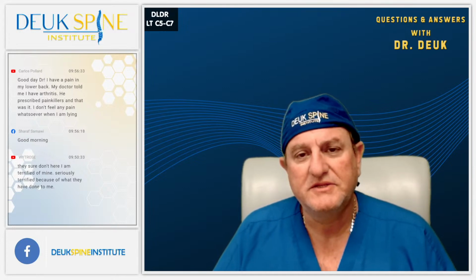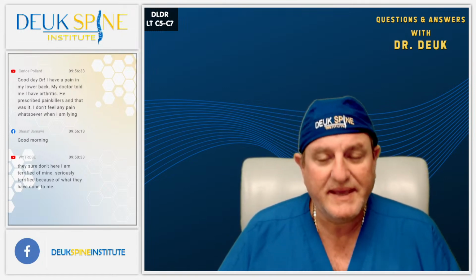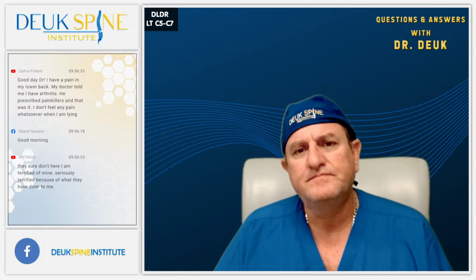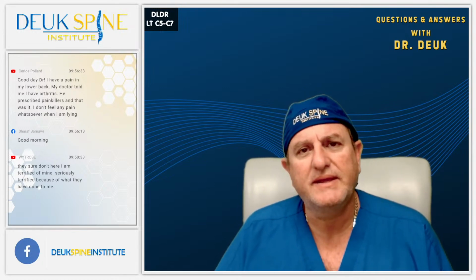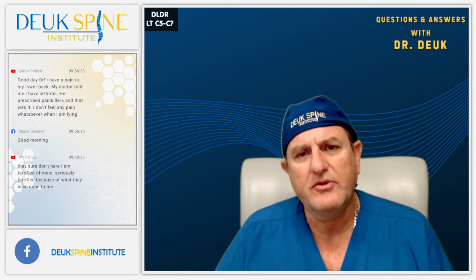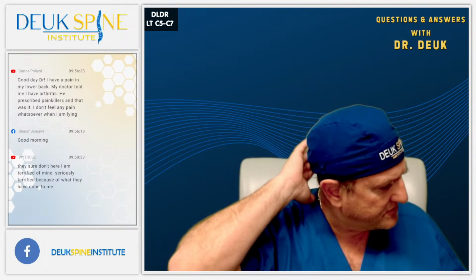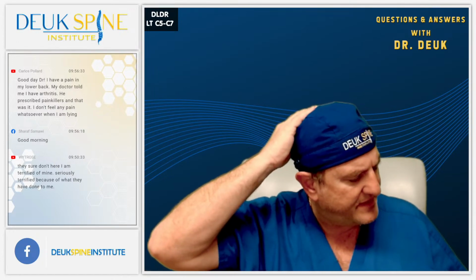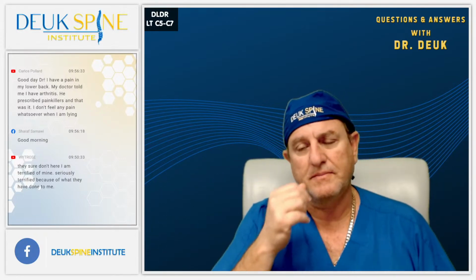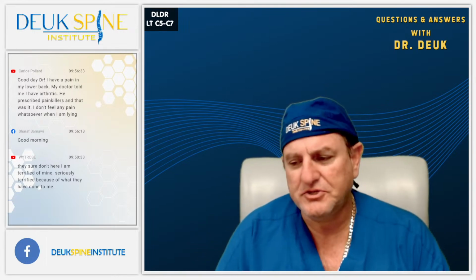And this is Dr. Deuk Majin. We have completed our surgery on our patient who traveled from Canada to have the Deuk laser disc repair done. And really, in essence, this is 2 herniated discs in the neck, C5-C7, one of them larger than the other, but both of them causing neck pain, pain in the neck, headaches called cervicogenic headaches that come from the neck up to the back of the head, pain radiating from the shoulders, neck into the shoulders called cervical brachial syndrome, and of course radiculopathy in the arm with some weakness because of the pinched nerve.